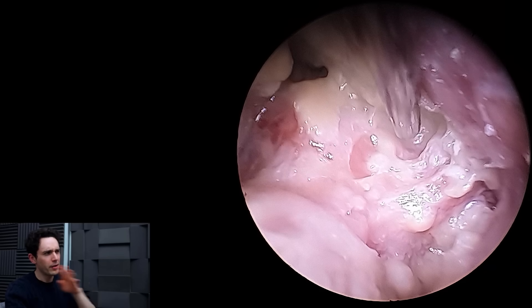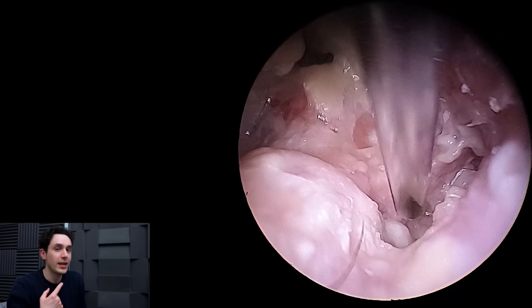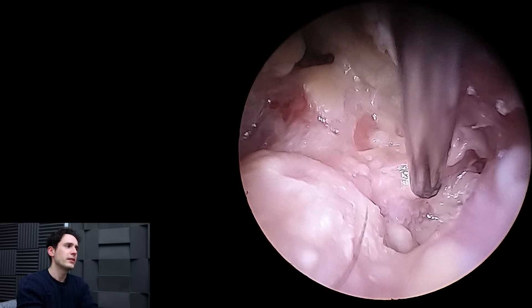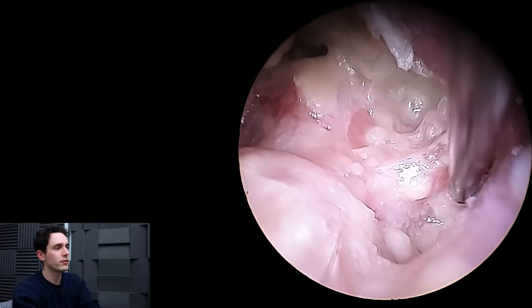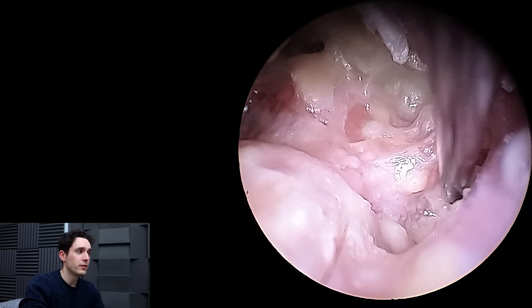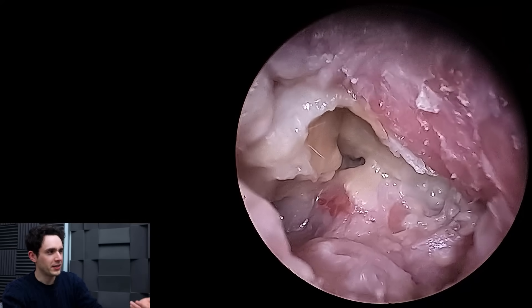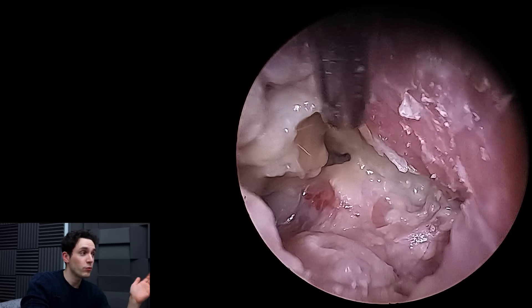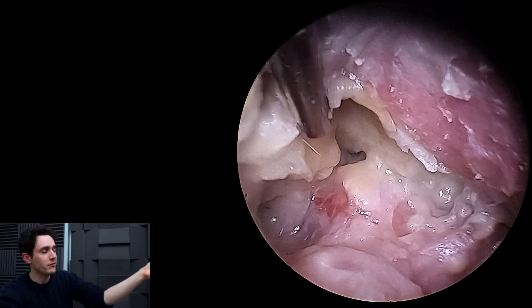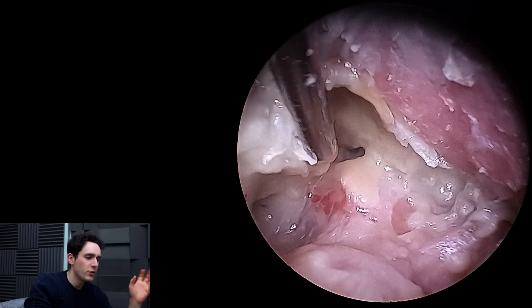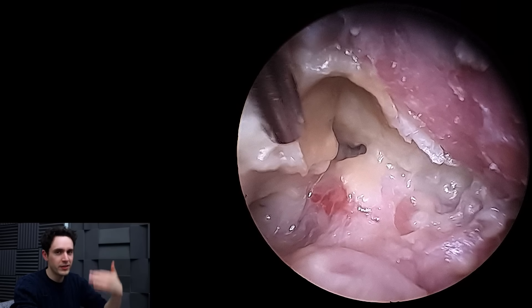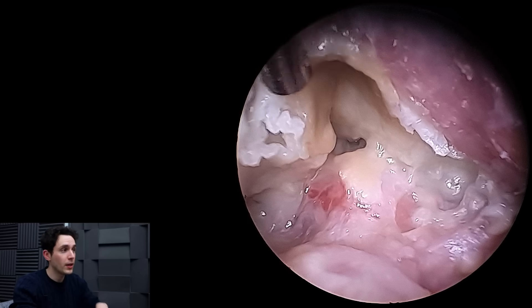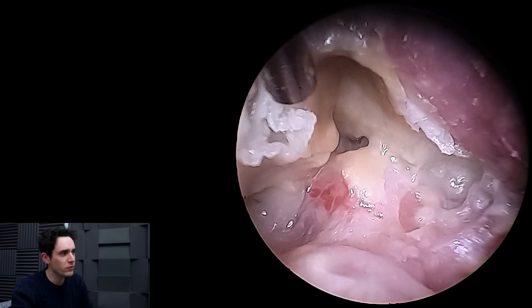So, an infected mastoid cavity. I then mentioned that this patient definitely has one canal cholesteatoma, and that's where my sucker is at the moment. A canal cholesteatoma is perhaps rarer compared to middle ear cholesteatomas, which is what would have necessitated the mastoid cavity to begin with. A canal cholesteatoma is where you have your ear canal — or in this case, what's left of it — and you have a trench or depression or divot in the ear canal, and dead skin starts to collect in that depression. Then it gets worse and worse, the bone starts eroding and so on.